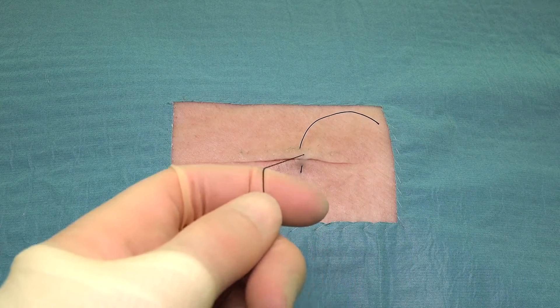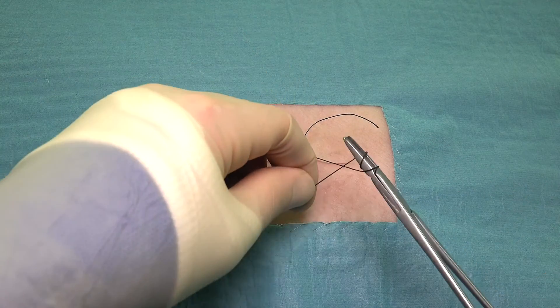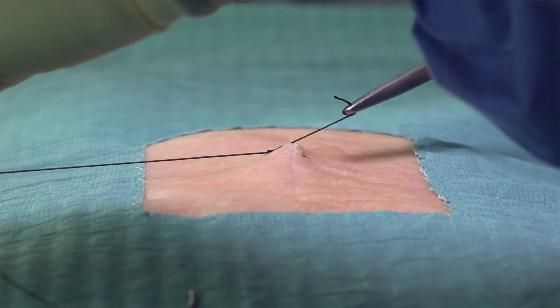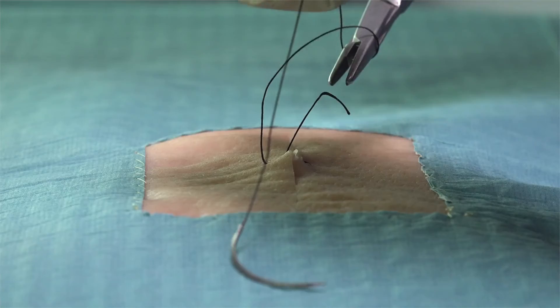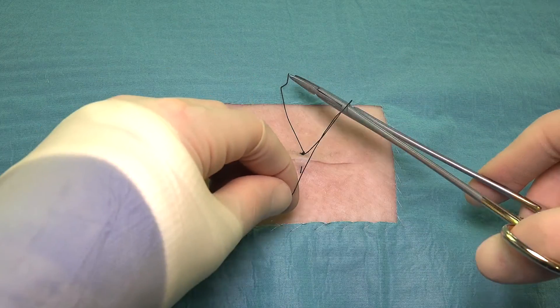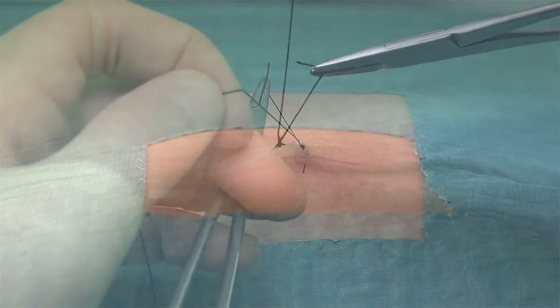Once the needle is back on the original side of the wound, the suture is then secured. Because we are dealing with a deeper wound, it is often better to perform an instrument surgeon's knot, as the extra friction of the knot keeps the wound opposed whilst we perform the other throws of the knot. When knotting the suture, we should avoid over-tightening, as this can cause the suture to cut into the patient's skin, resulting in cosmetically unpleasant marking.